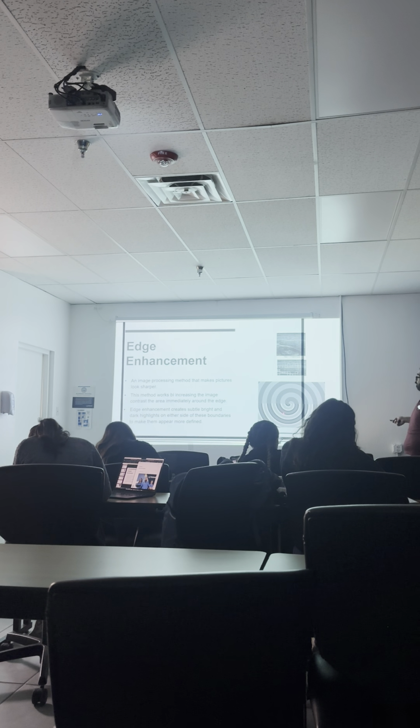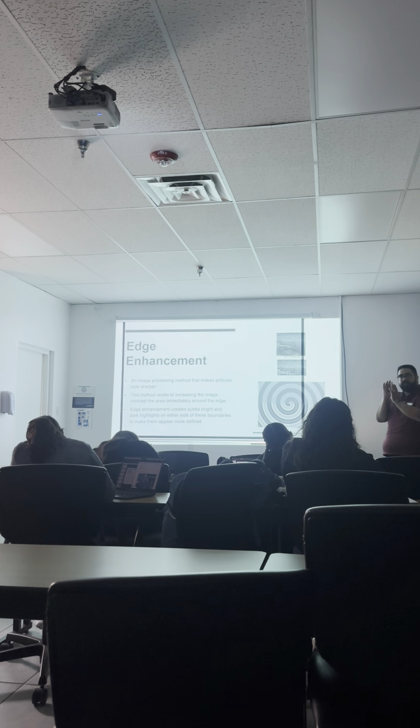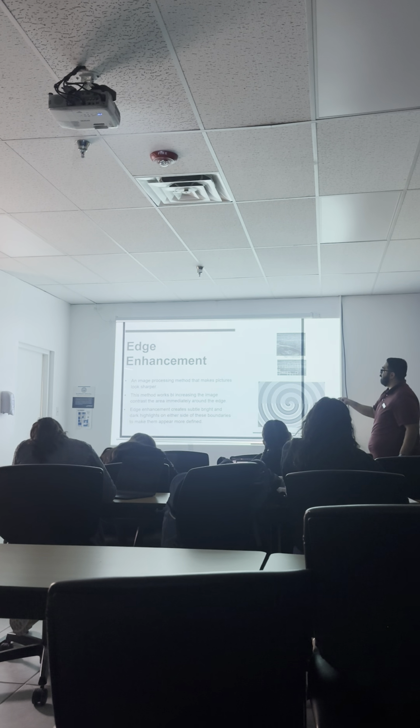You can tell them apart really well, but what happens at the border? The white, yeah, it's like a white echogenic one. It's amplified, right? The white is amplified, and what about the black? It's also amplified, right? Okay, so at this border, we could see the definite difference between the two tissue types, because at the border, they're enhanced.